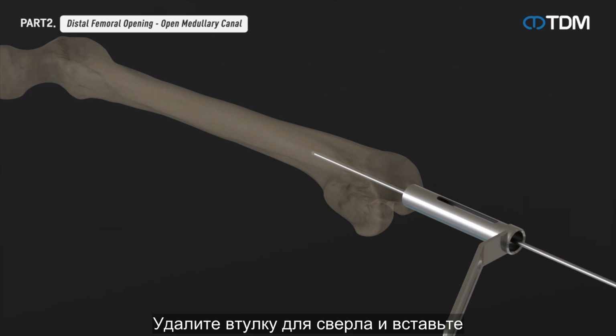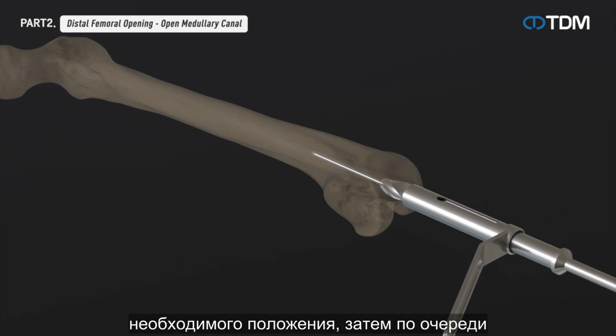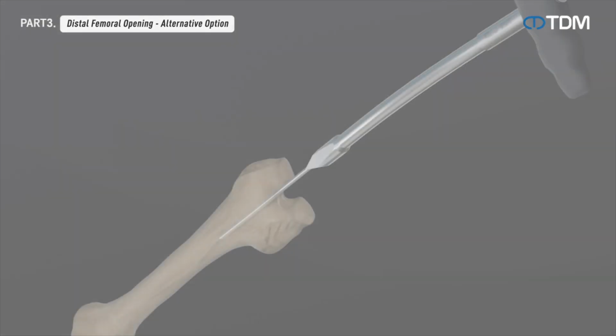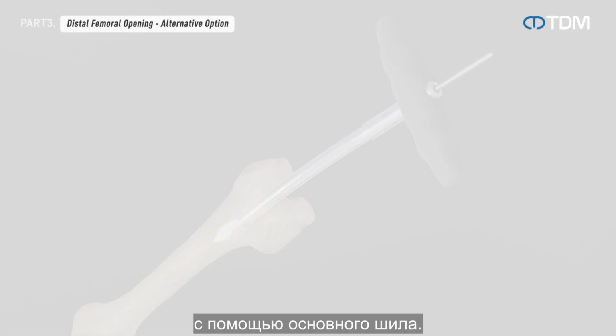Remove the drill sleeve and insert the open reamer along the guide pin to drill until the head of the reamer reaches the proper position. Then remove the open reamer and guide pin in turn. Alternatively, opening the medullary canal may be performed using a primary awl.